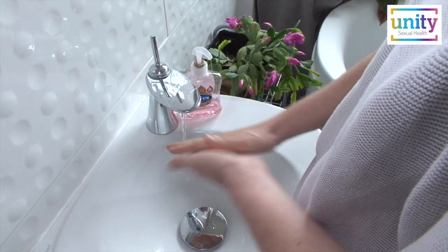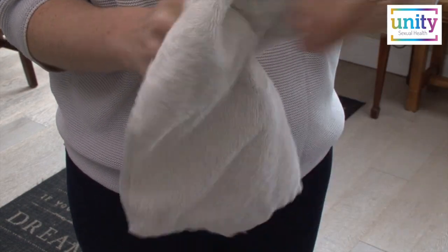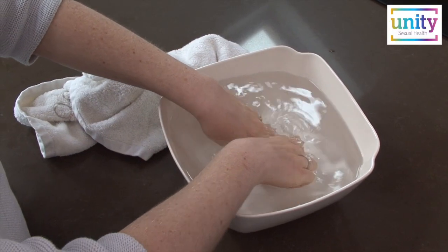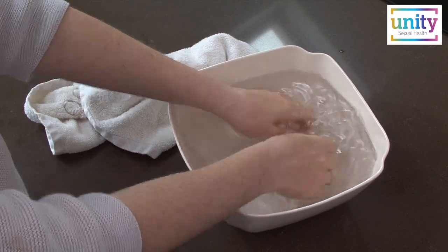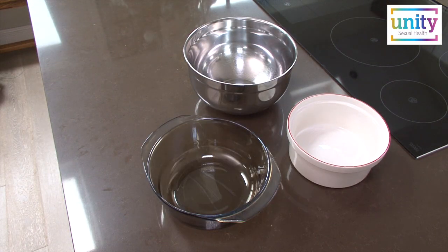Now wash your hands thoroughly with warm water and soap and dry your hands. If your hand gets cold you may not have good flow running through your fingers, so if this happens fill a container with warm water to bring heat back into your hand. The water should not be so hot that it burns you. Any container will work so long as it is big enough to have enough water in it to cover your hand.